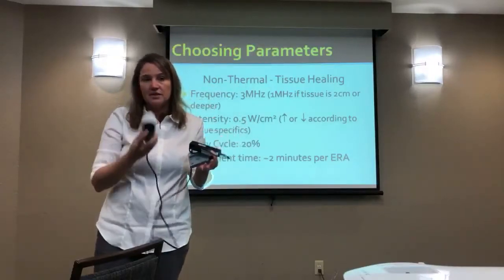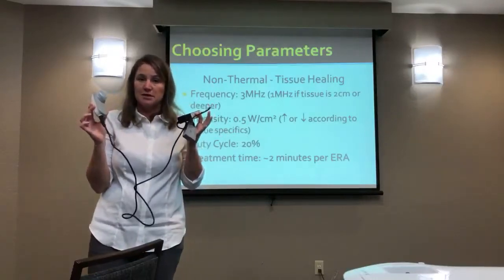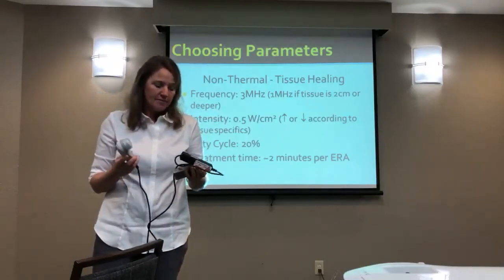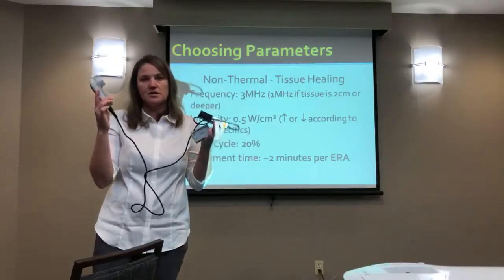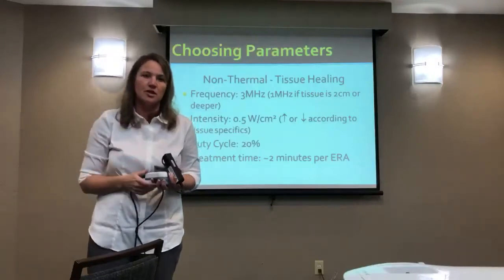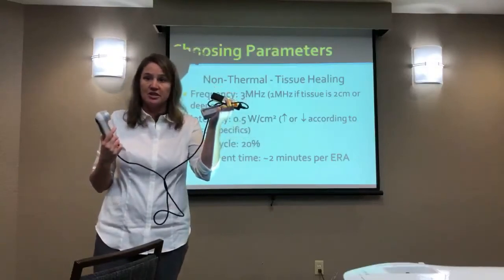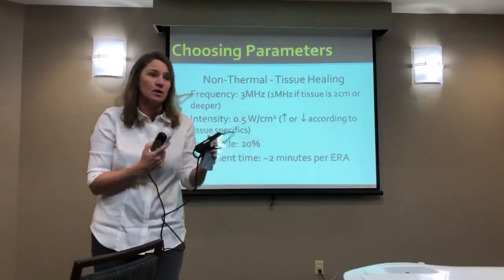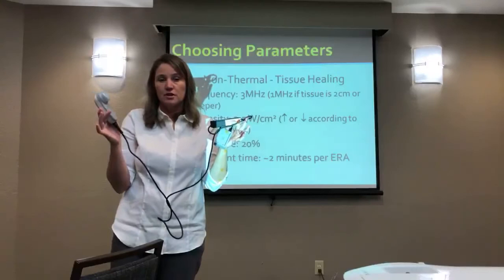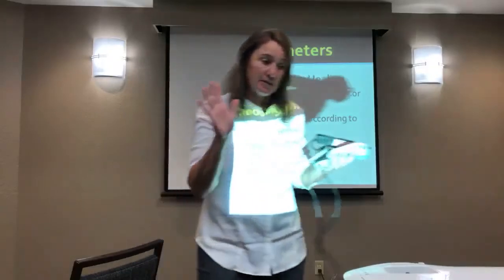I have seen other devices advertised for like $100. This one is, I don't know the exact price, but it's over $1,000. It's far more than the ones that you can see in these magazines. So this one has much more power, and it's designed to mimic the same amount of energy you can get with a clinical model. You need a bolus of energy. So when we do our lab, you guys can play around with this one and use it. This is as portable as I know you can get for sure. I'm not aware of any more portable devices that can create that kind of power, but I'm not saying they don't exist.